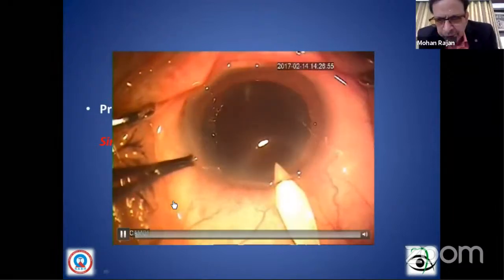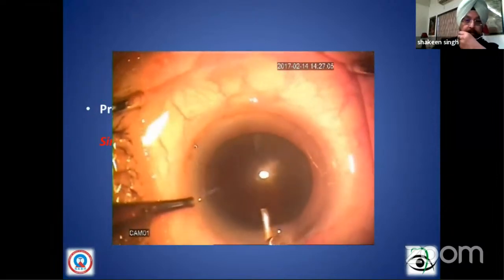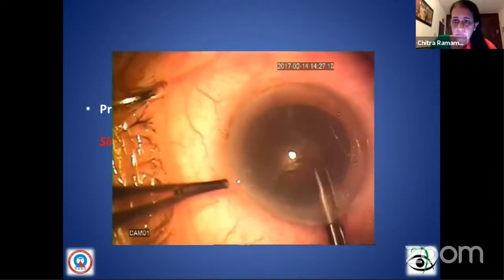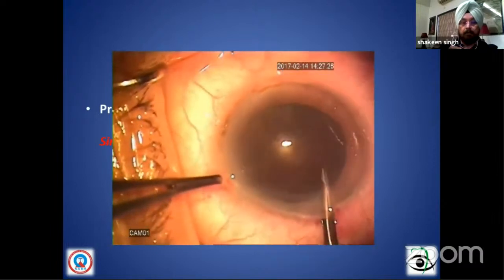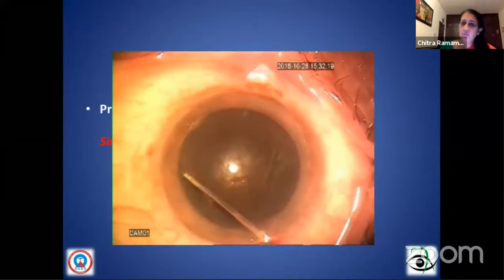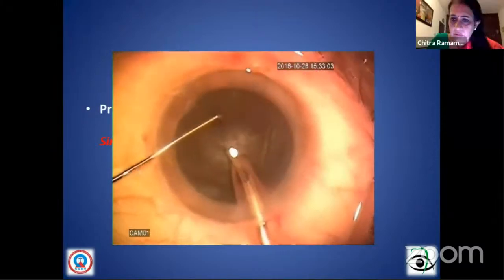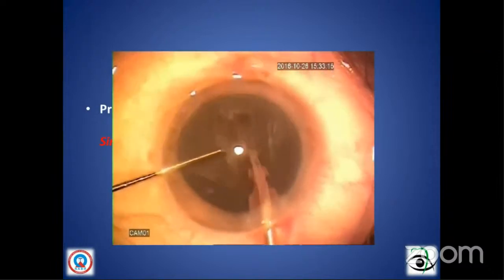Not able to hear you, Shakeen. So this is the first case I'm going to share with you. Is it? Am I audible? Yes, sir. The usual capsulorhexis, which is this. These steps are common in all these cases. You're not audible at all, Dr. Shakin. Should I do it again? Yeah. Am I audible now? Yeah. I think you should keep holding the mic in your hand, sir, close to your mouth.